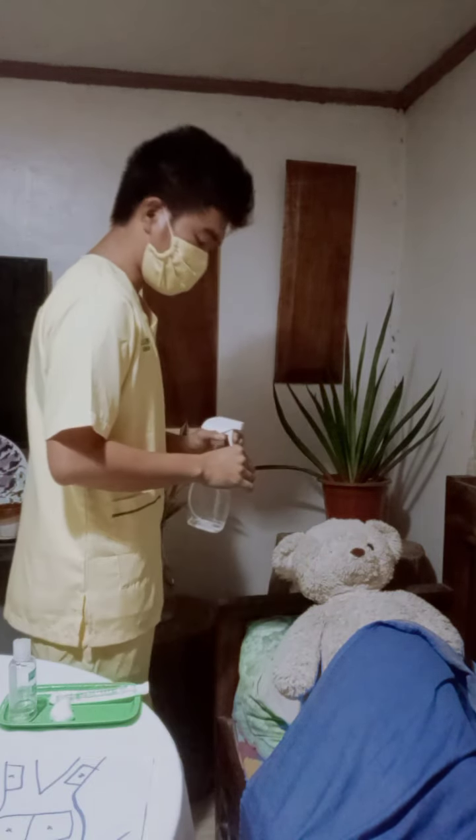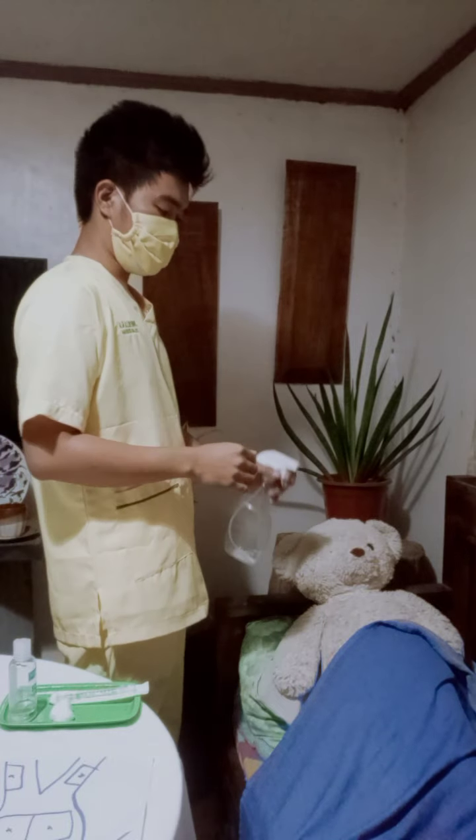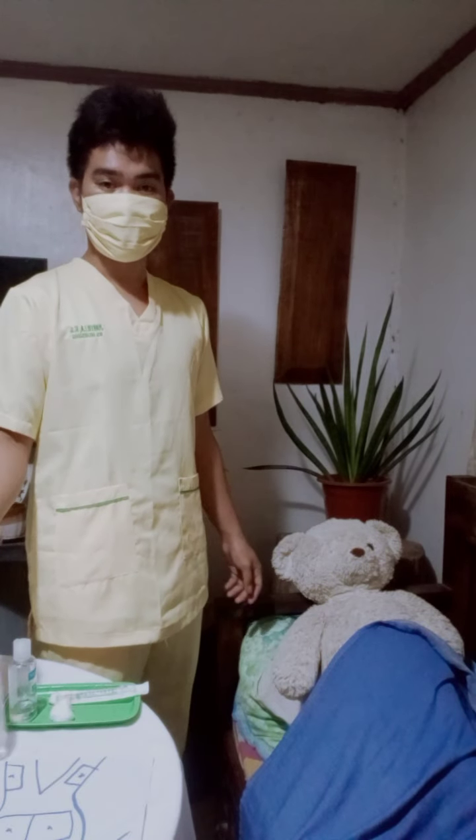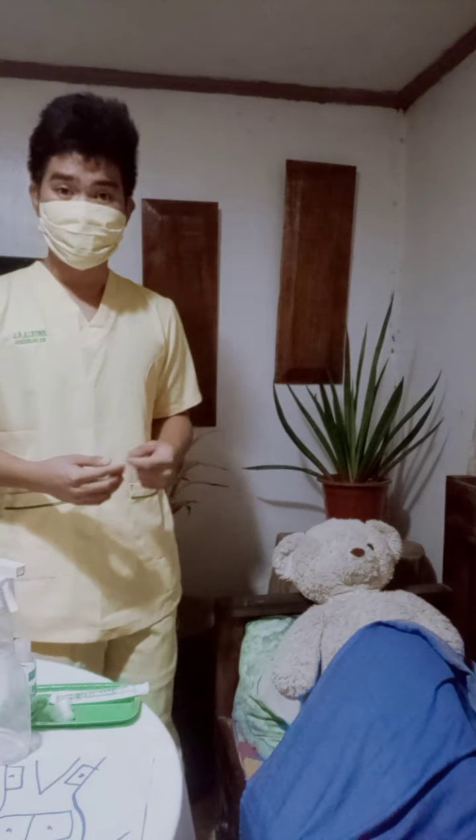Then allow our patient to do the same, just like what we did. We're going to give her an alcohol or other disinfectant, assuming he or she is already done disinfecting her hand. After that, have the patient manipulate the syringe and explain what the parts of the syringe are that need to remain sterile.